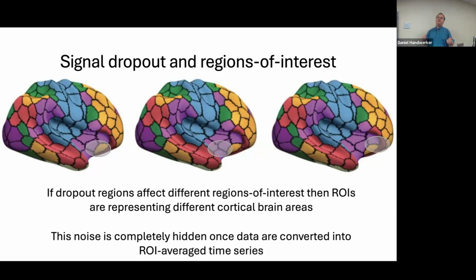So if you have a study saying, I have 5 regions I care about, and I'm studying the connections between these 5 regions, you could say, in 20% of my subjects, I'm missing one of these regions and I remove those connections. If you're doing a method that involves whole brain connectivity, like graph theory measures, which bootstrapping is often done with, but a certain number of your regions of interest are missing in a certain fraction of your subjects, that's going to affect all the measures everywhere.